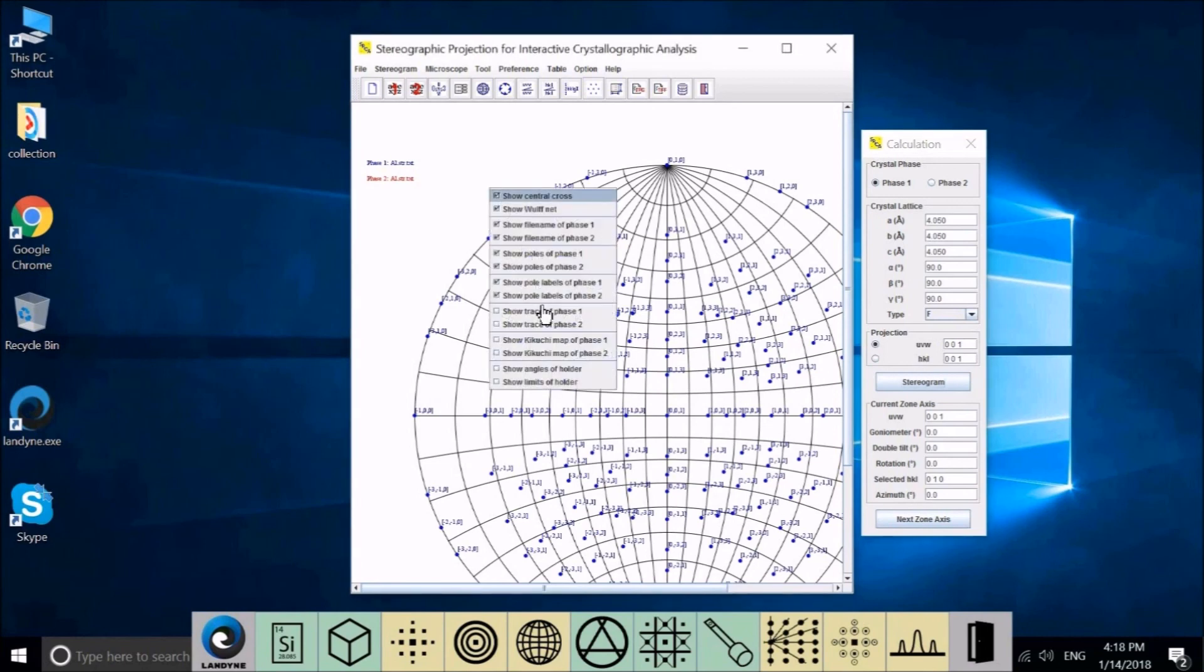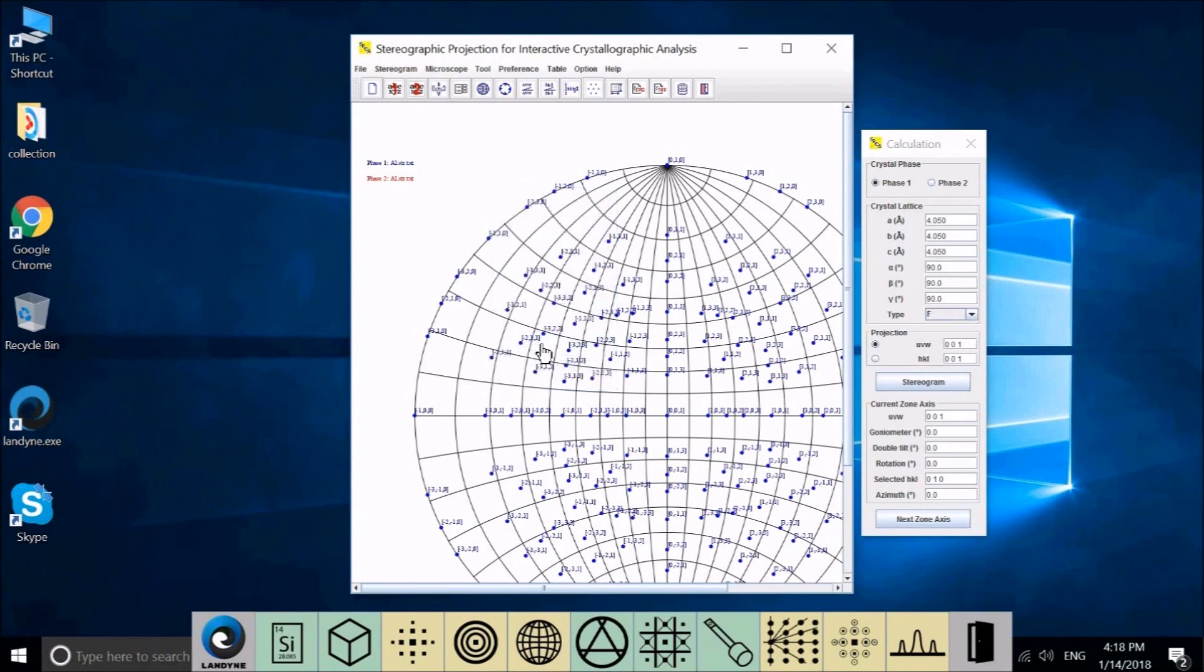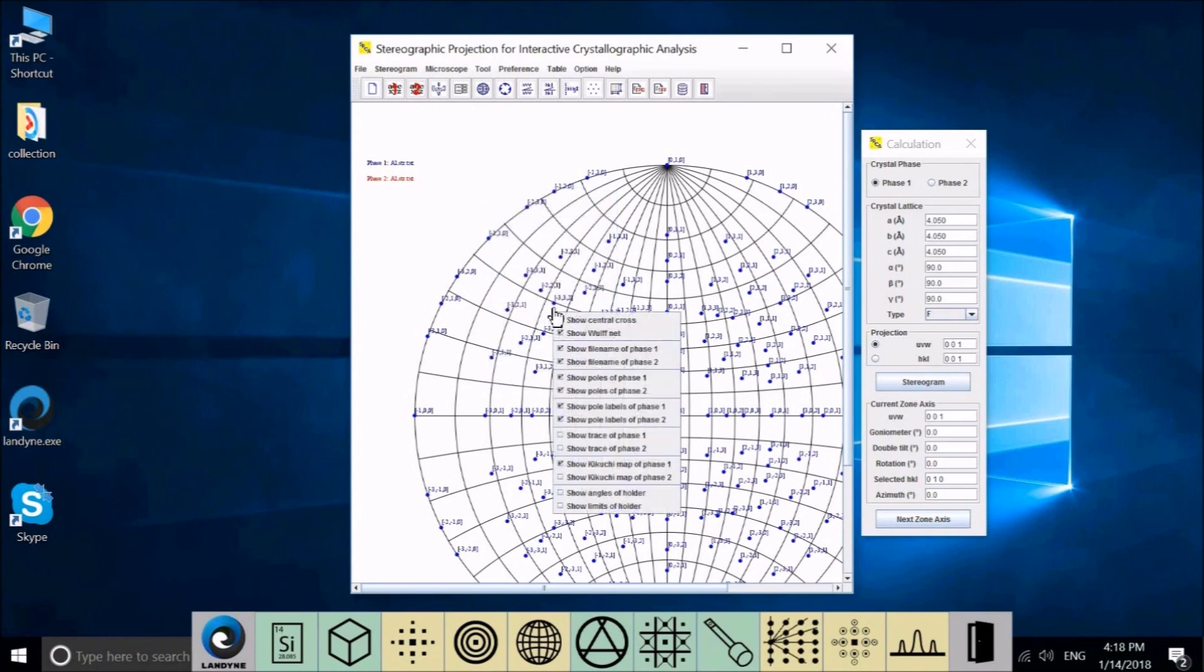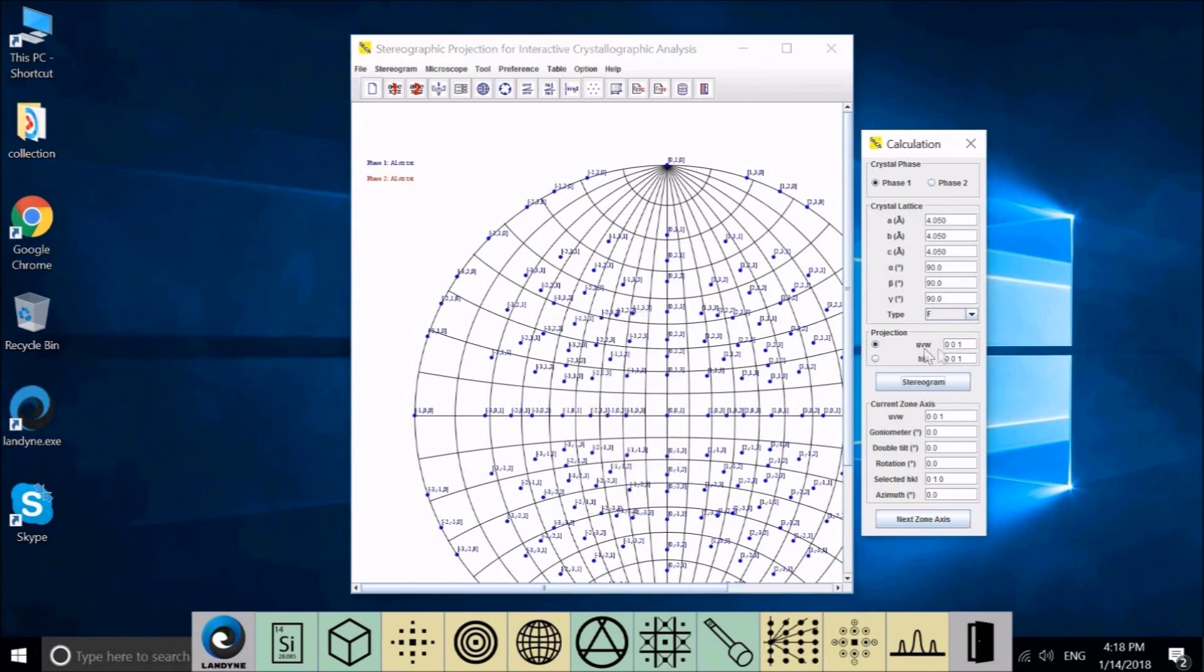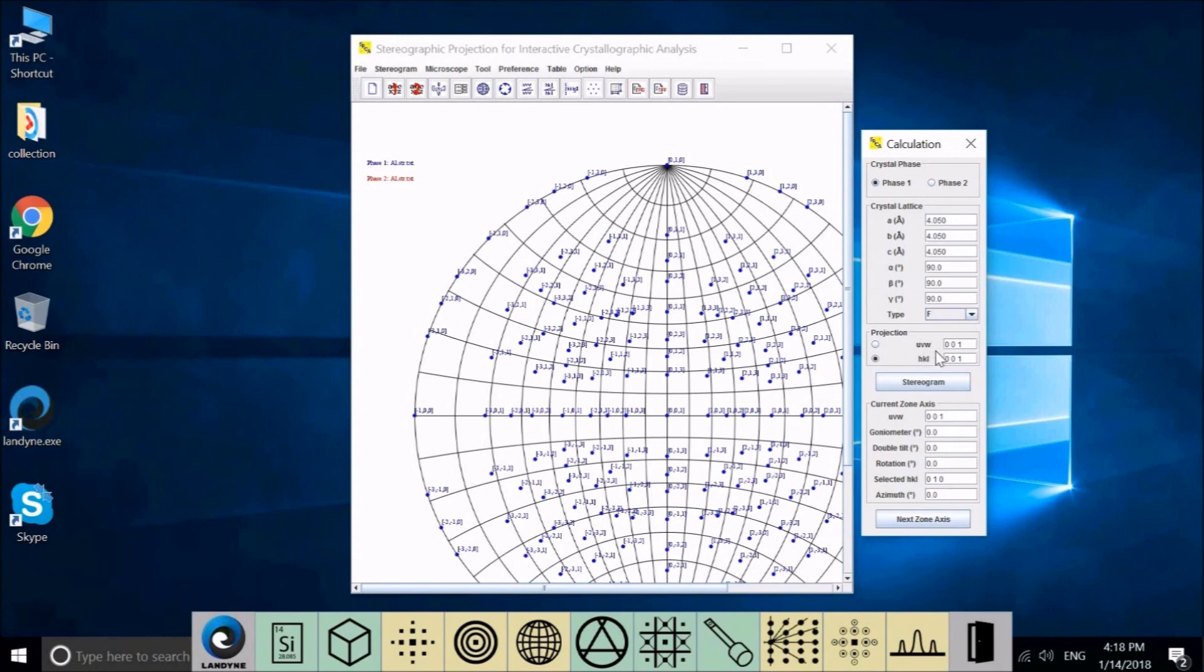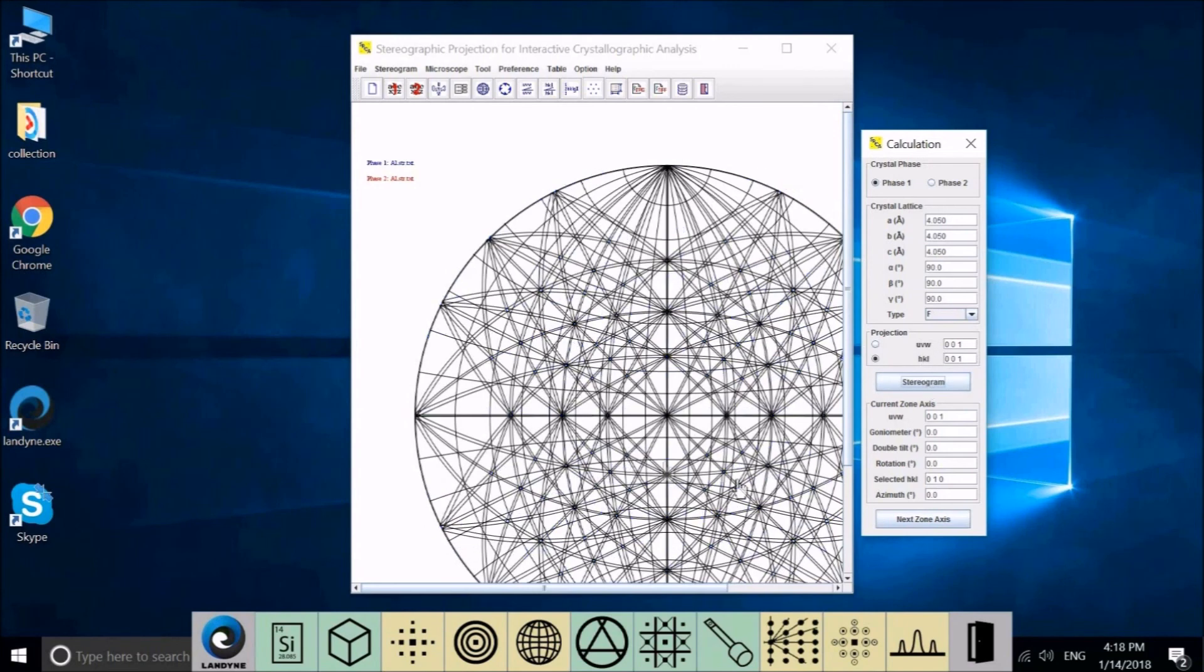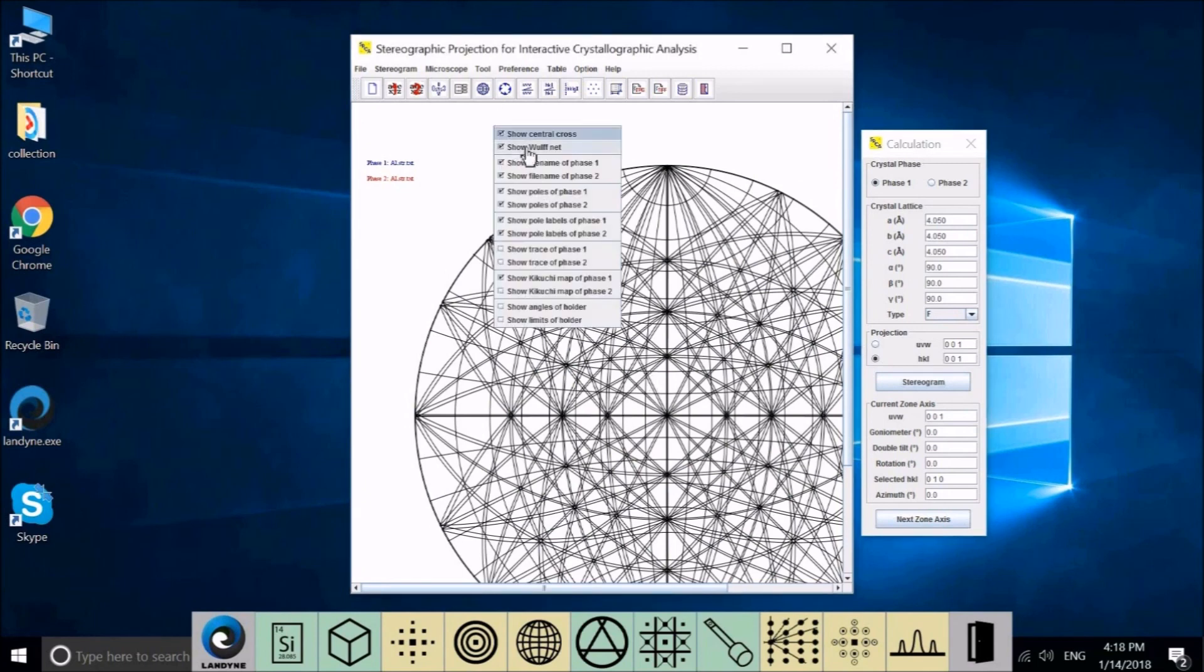Now before we do that, we can reduce the pole range for phase two to 2, 2, 2, so generating Kikuchi lines will not be that dense. Again, close here. Start clicking here. And now we can select for phase one to show the Kikuchi map.